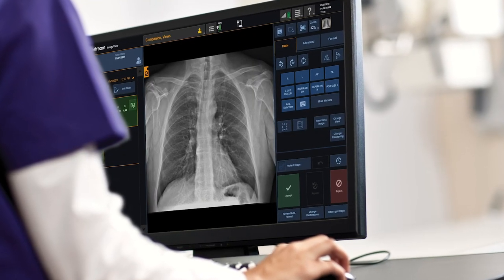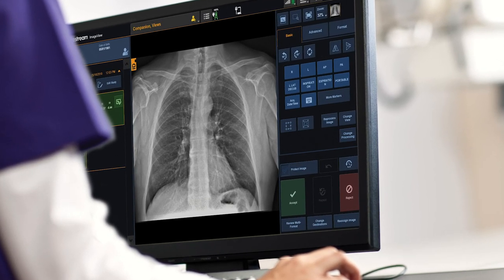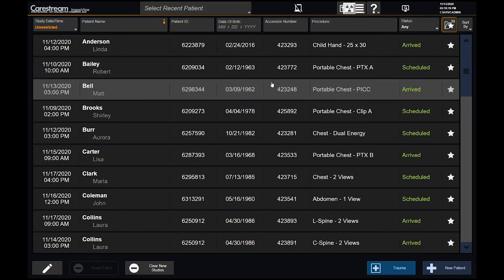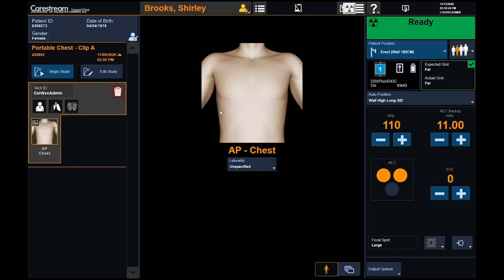DRX Evolution Plus uses ImageView software, the same platform as all other CareStream systems. This common user interface significantly reduces training time and allows consistency among users. ImageView software provides single-screen viewing, so your commonly used functions and tools are all on the same screen, reducing the amount of button clicks. The left side stage is where the patient examination information is found for each study, while center stage is the largest area for image review and post-processing.